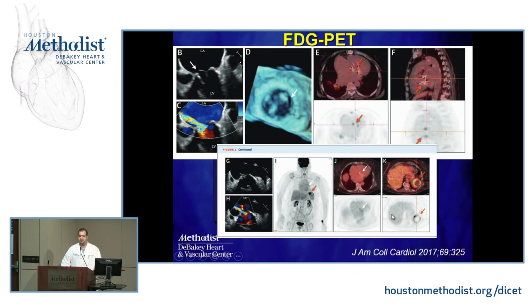Two more slides about FDG PET, since this will be coming to this institution. You have this patient with a bioprosthetic mitral valve who has severe eccentric mitral regurgitation. And what you can appreciate on the FDG PET is this high signal uptake at the base of the mitral surgical frame. And that's abnormal.